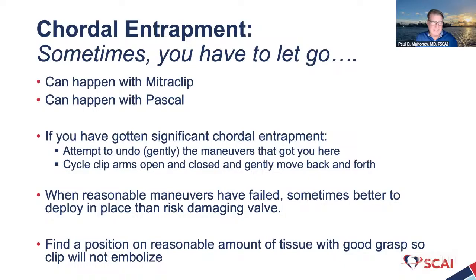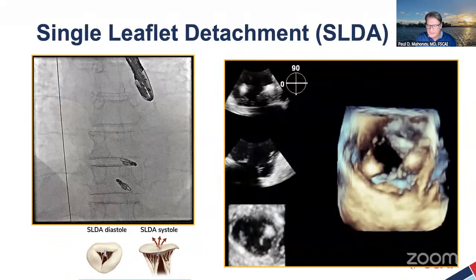However, there will come a time when reasonable maneuvers have failed, and sometimes it's better to just deploy in place rather than risk damaging the valve. So find a position on a reasonable amount of tissue with good grasp so the clip will not embolize. All right. Once you've done that, we can now go on to the next major topic, single leaflet detachment.